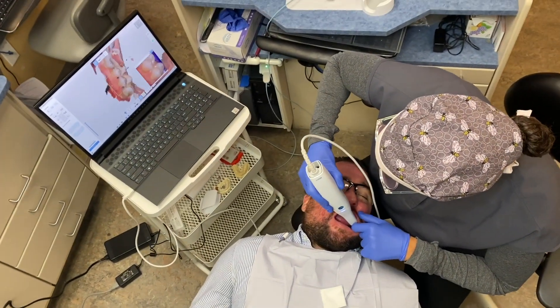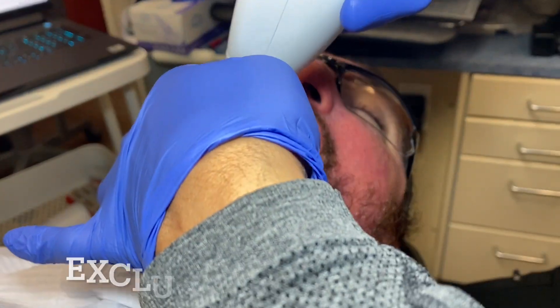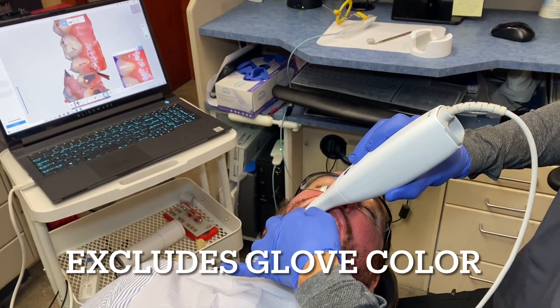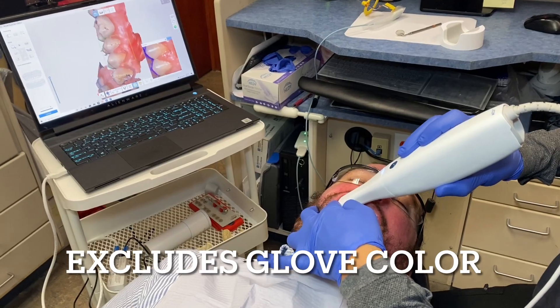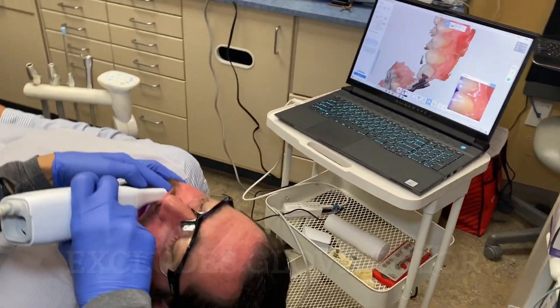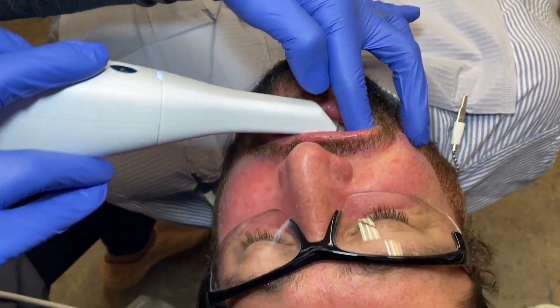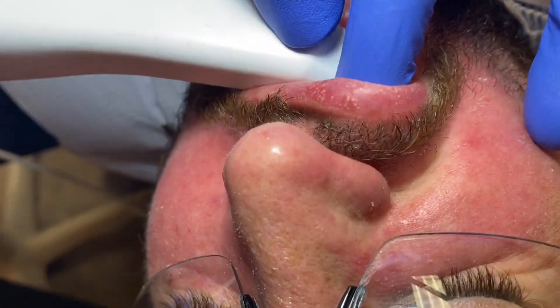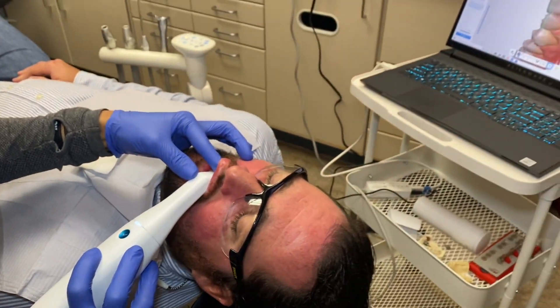Let's talk about the gloves for a second because it's an interesting feature. See how it's not picking up your gloves? Yeah. Your glove color is in there — we put it in there. So the glove color can be registered. In fact, three colors can be registered so that they're excluded with the artificial intelligence, which makes scanning a lot easier.